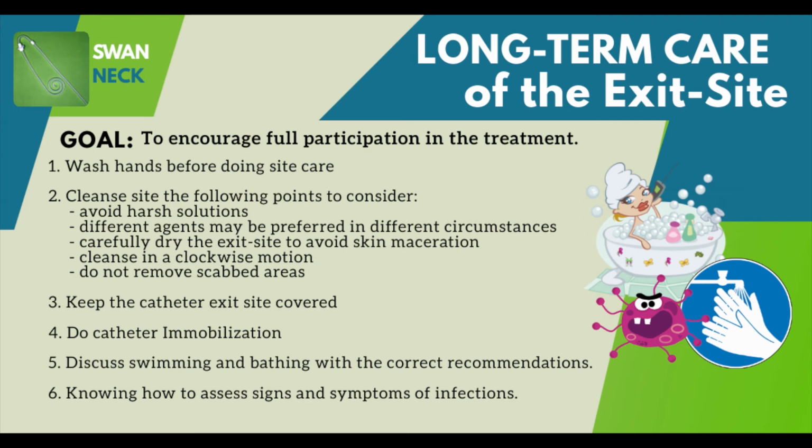As with any wound, care is aimed at keeping the site clear of exudate or debris that could encourage bacterial growth. Protocols include washing hands before doing site care, cleansing the site, with the following points to consider. Avoiding harsh solutions as they have the potential to cause skin damage, which may predispose to bacterial colonization. Different agents may be preferred in different circumstances, such as antiseptic solution in an immunosuppressed patient.